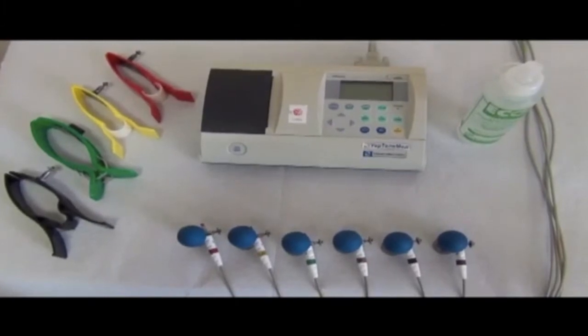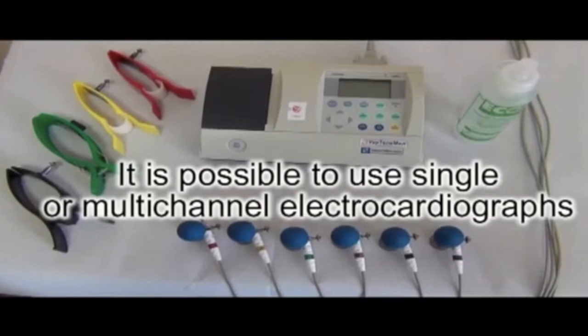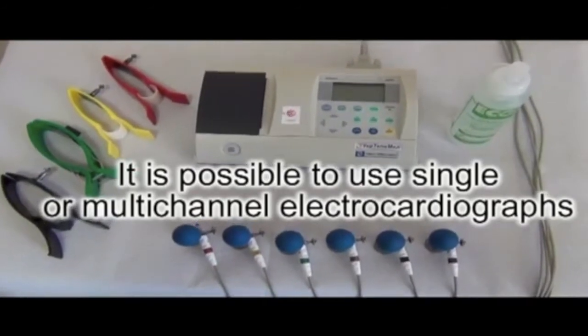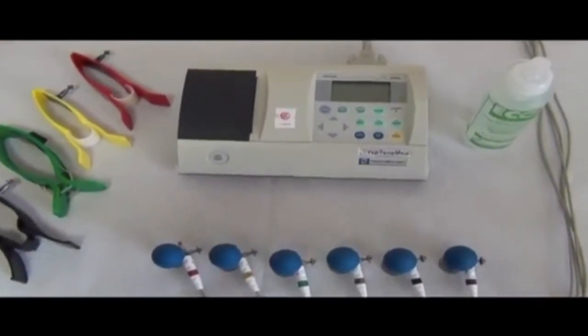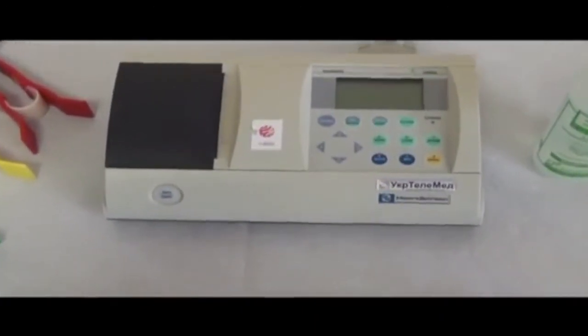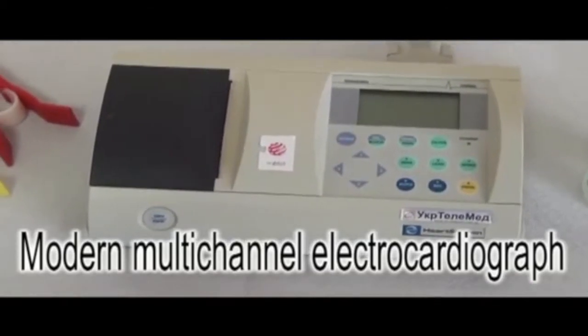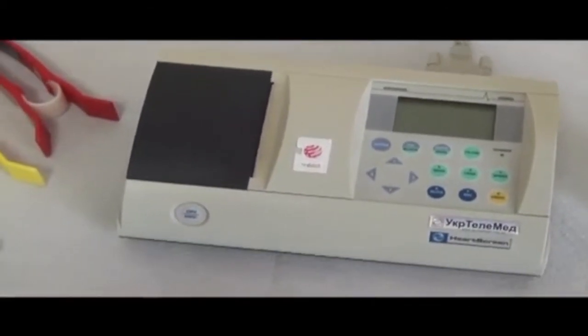For registration of ECG, it is possible to use single or multi-channel electrocardiographs. Modern electrocardiographs allow simultaneous registration of electrocardiogram in 12 leads. For registration of ECG, we should prepare the ECG apparatus and electrodes for it.